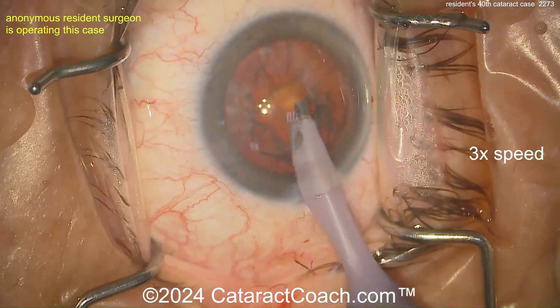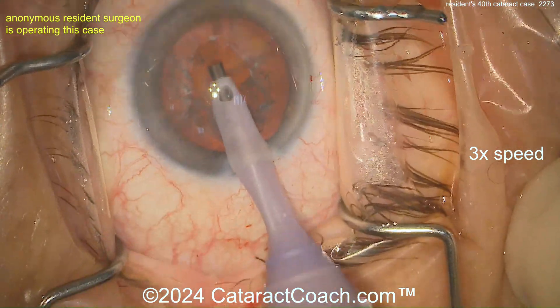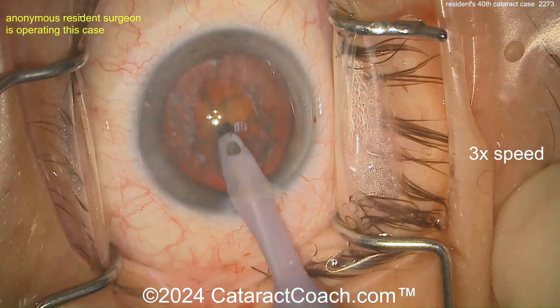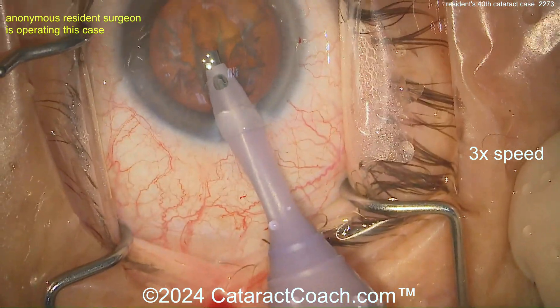It looks like that bevel orientation is probably set up for a groove — and I am right. Look at that groove right down the middle. Nice to have a second instrument in the eye even when you're grooving. There's a groove down the middle — pretty good, I like it.